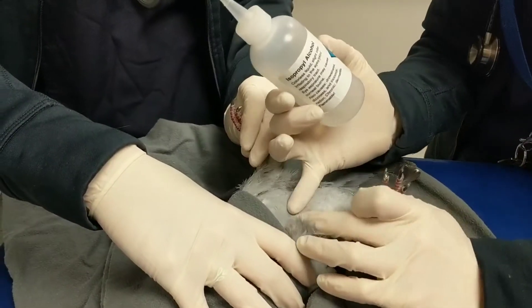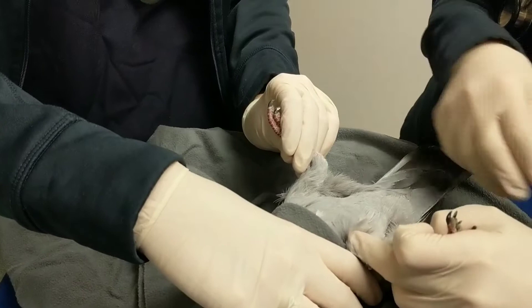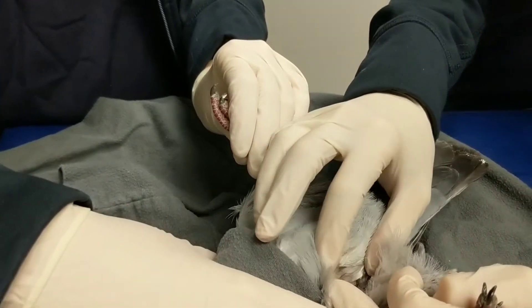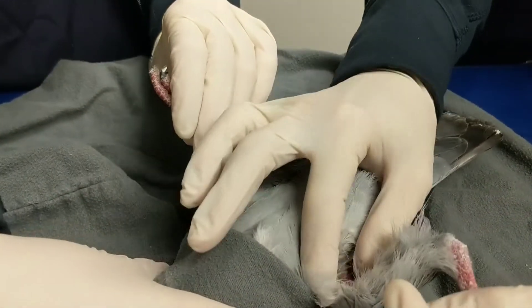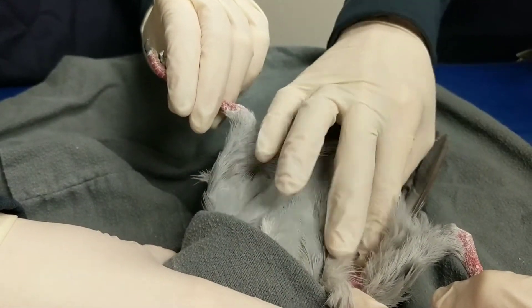And then she's going to use her other hand to manipulate the legs. So the inguinal fold is just right here — and you can see on this drumstick there's this little flappy area here, and that's where we're going to aim.